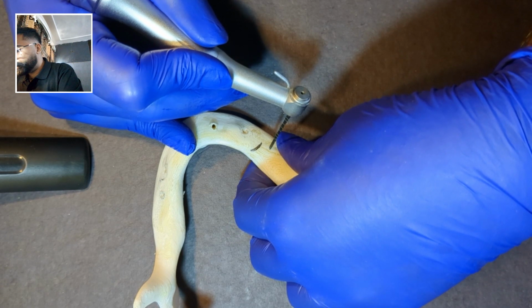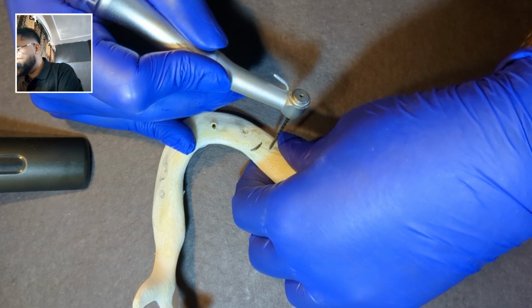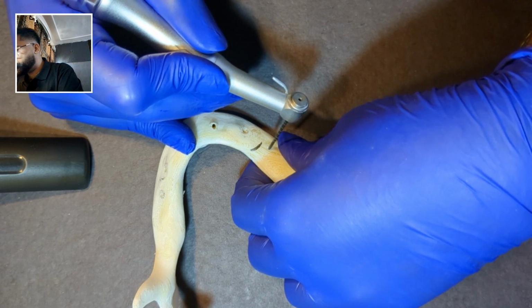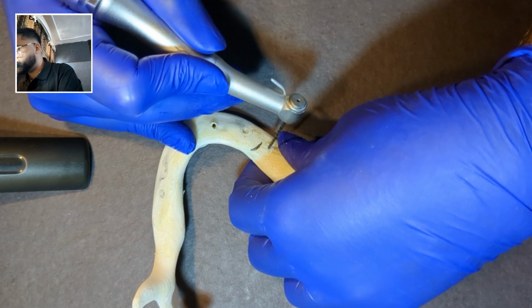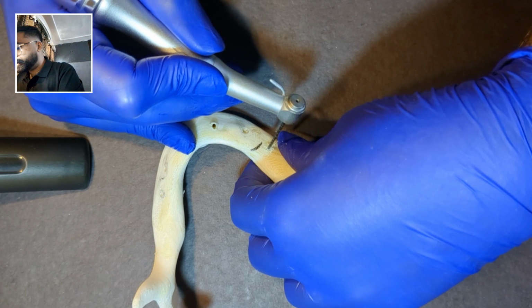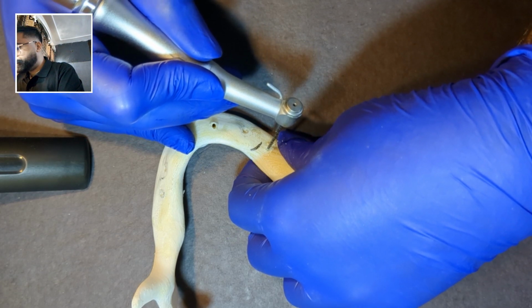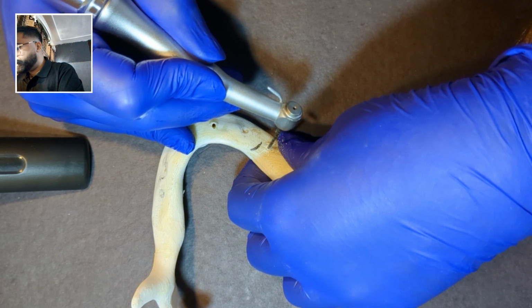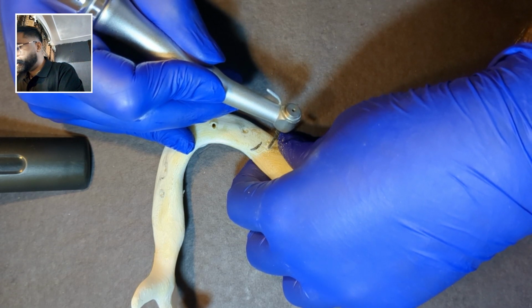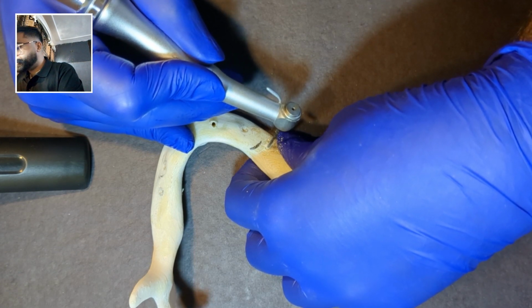So what I'm doing, I'm drilling the first cortex now. The first cortex is drilled. Now the bone becomes soft and I'm entering the cancellous bone. Now I am able to feel the second cortex, right? So I will stop my drill just when I feel the tip of my drill touching my finger.